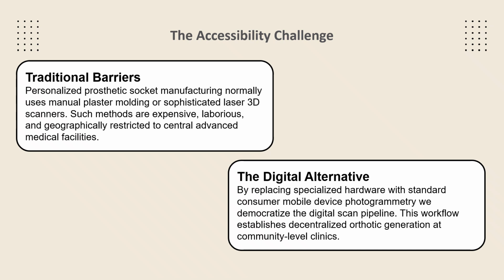By replacing expensive proprietary hardware with standard consumer mobile device photogrammetry, we democratize the digital scan pipeline. This open software-driven workflow bypasses centralized infrastructure entirely and provides an accessible basis for decentralized, patient-specific orthotic generation directly at community-level clinics.